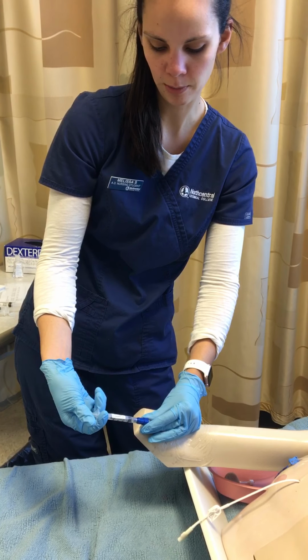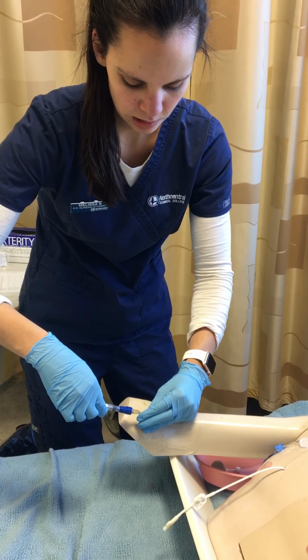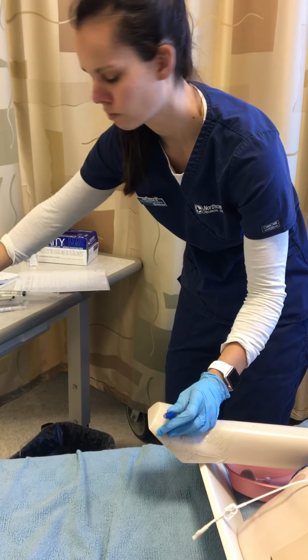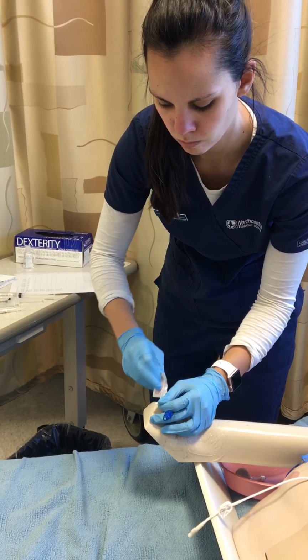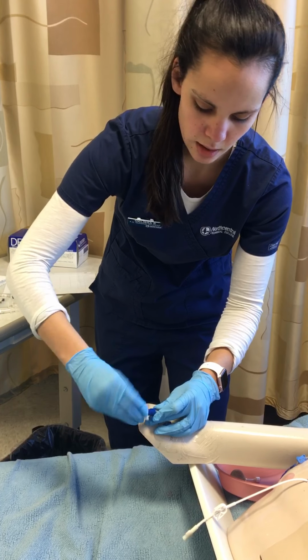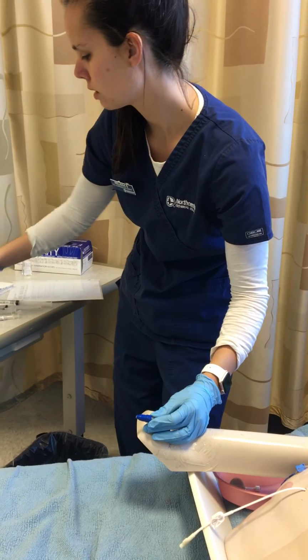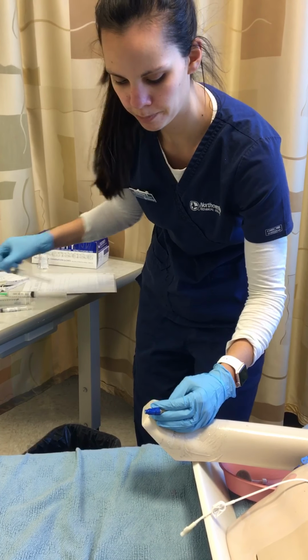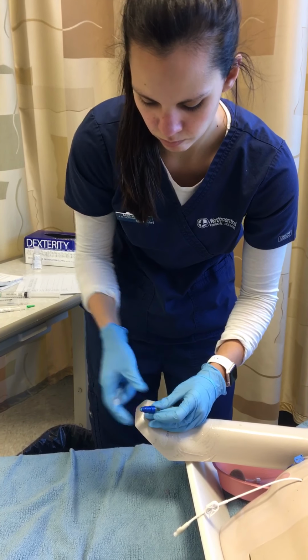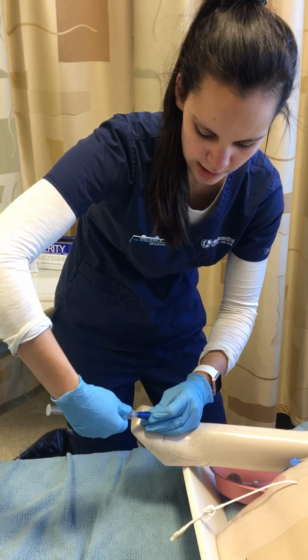Okay, so it's been 5 minutes, and then I would clamp it. Clean the cap again, 15 to 30 seconds. And then I would give my flush again at the same rate.